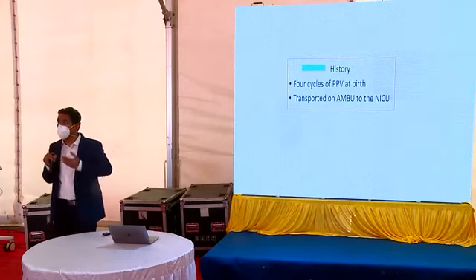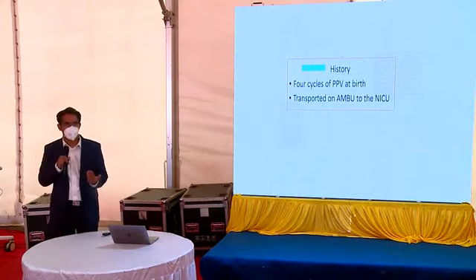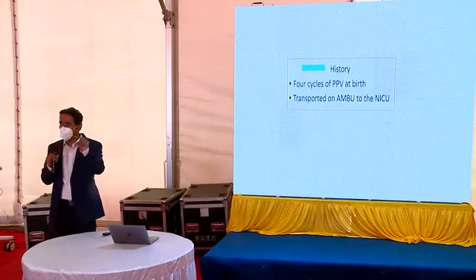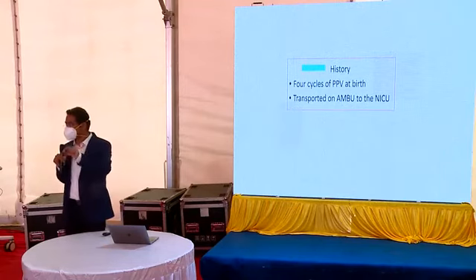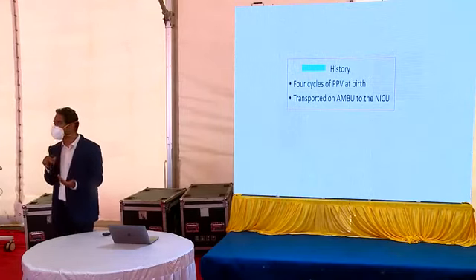Inadequate ventilator support. So again, we need to look at what is happening in the ventilator. What are the set parameters? Are they right? And whether the same things are being delivered or not. So another common mistake you do is, in most of the ventilators you have 2 screens, the set parameters and the delivered parameters. So when we say see what is happening, the set pressure is 20. That doesn't mean the same thing is delivered to the baby. So go to the screen where the measured parameters, the parameters that are delivered to the baby, are being displayed.